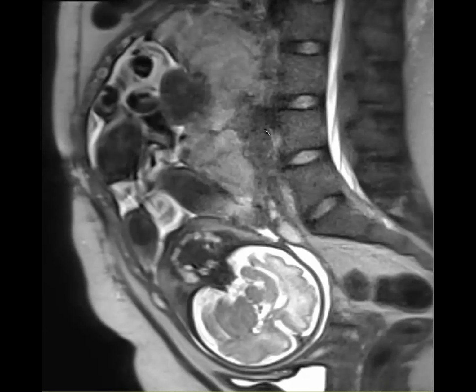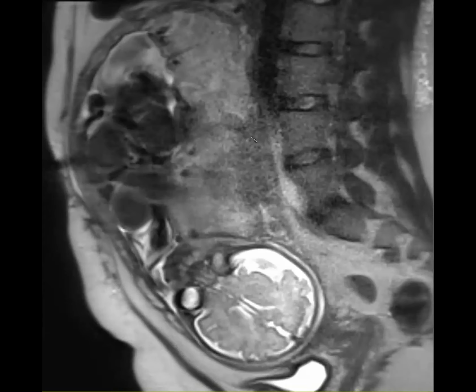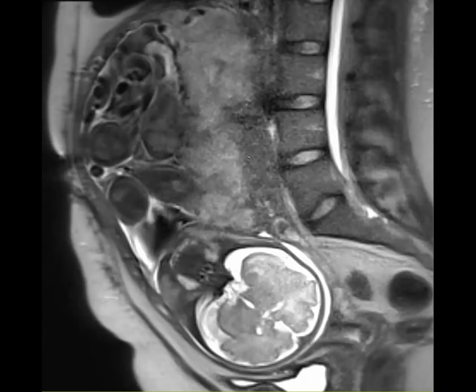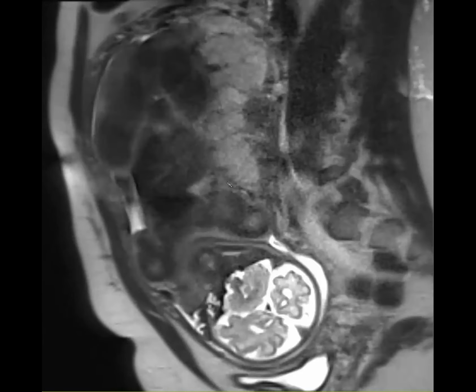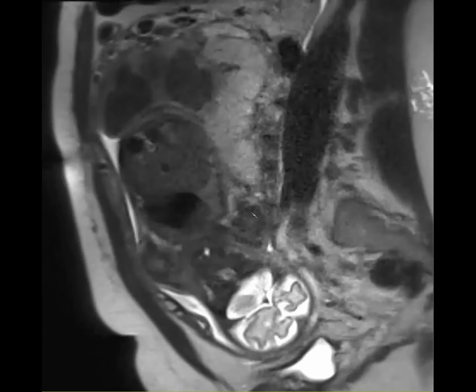On ultrasound, they were saying that they couldn't see the myometrium well, but I think it might be because it was so far along in pregnancy. Yeah, so I think the suspicion for a high placenta like this and posterior would be much lower than if it was in a different location. Yeah, cool. And then I thought this was probably a fibroid. That's just incidental.